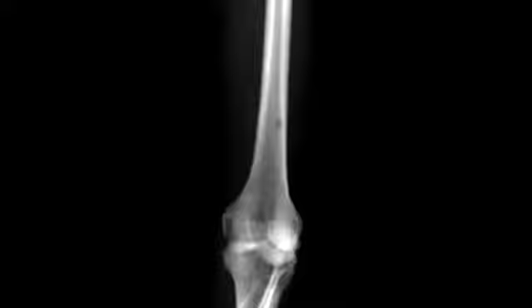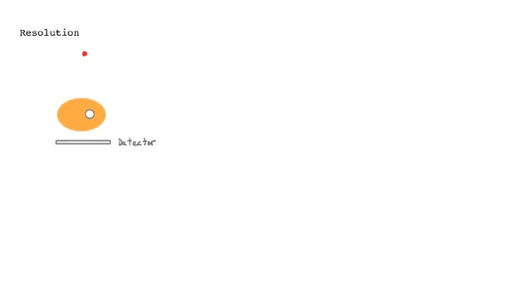So contrast is one dimension of image quality, the bone or other tissue standing out against this background, but there are other dimensions as well. And so let's talk about the next one, which is the resolution of the image. So the image should be sharp and not blurry. So let's talk about what makes an image sharp or blurry. The parameter we're talking about is resolution, spatial resolution.